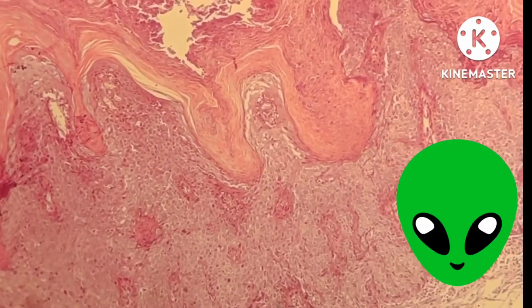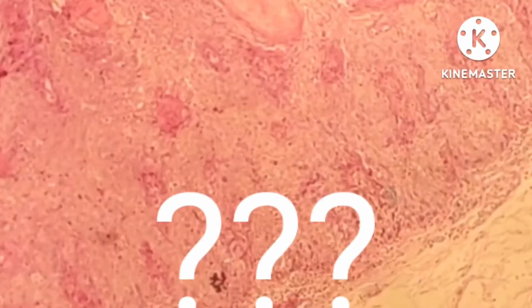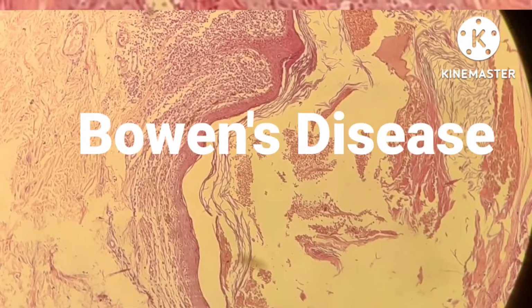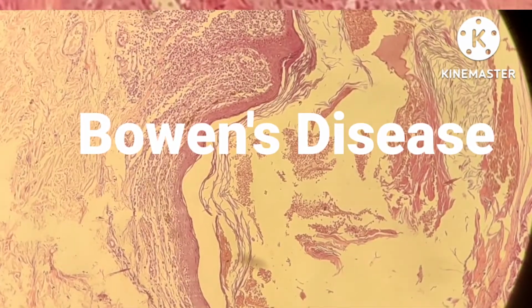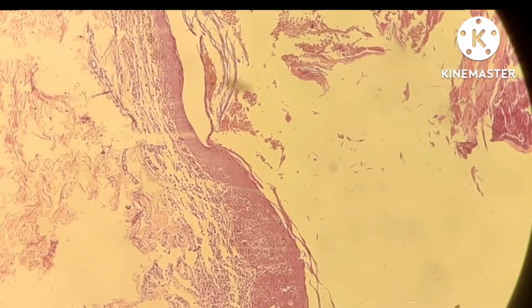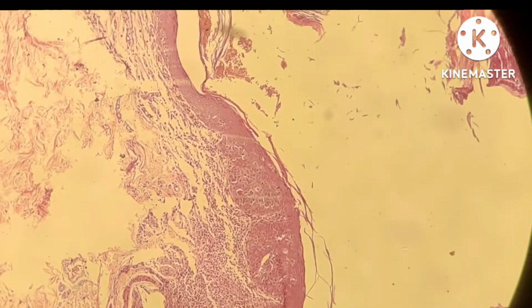What is it? Bowen's disease. Let's listen to Anuradha. She is going to read about all the features from the book. Bowen's disease is a form of carcinoma in situ and accordingly shows full thickness involvement of the epidermis and sometimes the pilosebaceous epithelium by atypical keratinocytes.